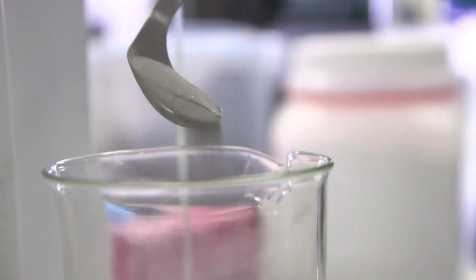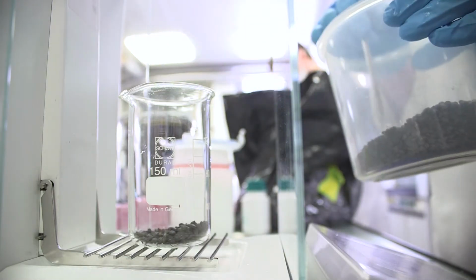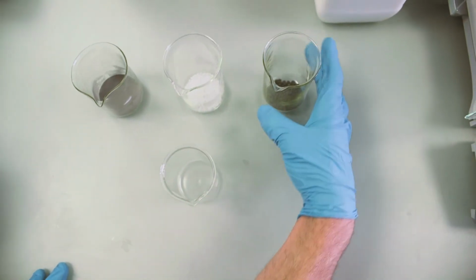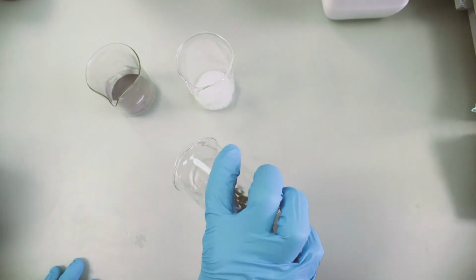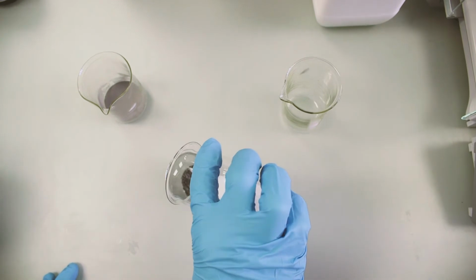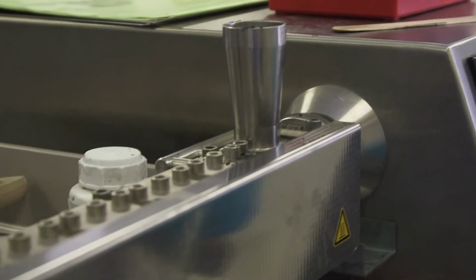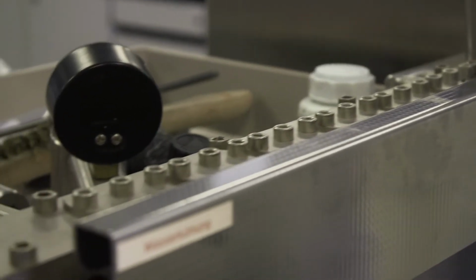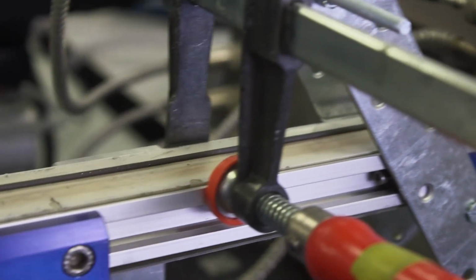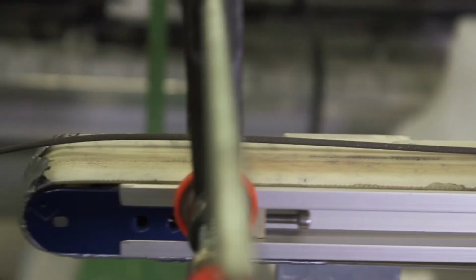For printing magnets, we first had to develop a filament with a high loading of magnetic particles that was processable on a 3D printer. This is quite a challenge. On the one hand, you want to put as much powder in as possible to have strong magnets. On the other hand, you want to put in a decent amount of polymer to make a filament flexible enough to be spooled and stiff enough to be pushed through the printing head. We iterated with many polymers and compositions, tested for printability, mechanical and magnetic properties, and started over again.